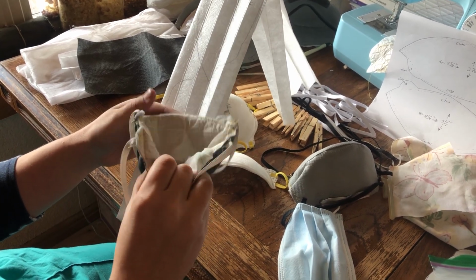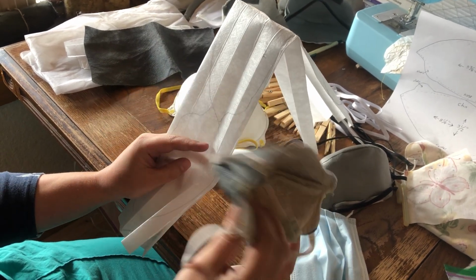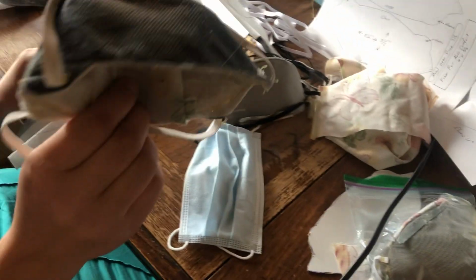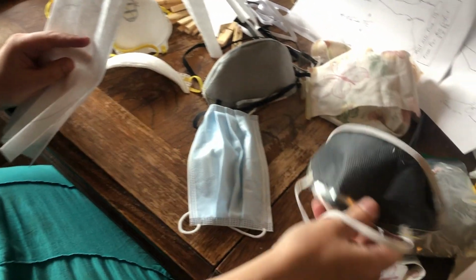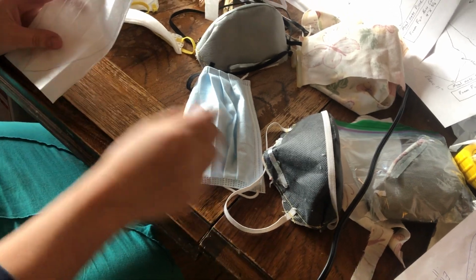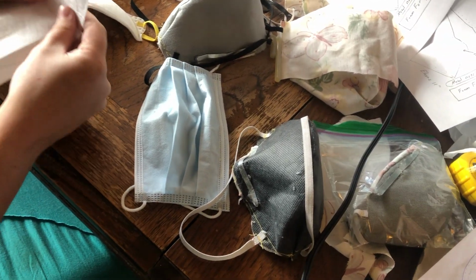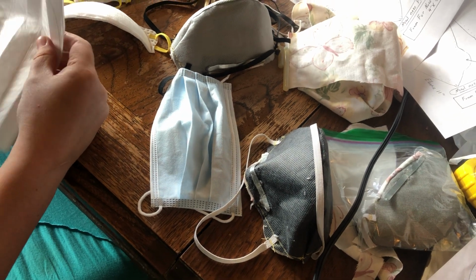So this first one, I put this layer on the inside of my mask, and it was itchy. So that is my first mask, which has shrunk in the dryer. It no longer fits me. I'm going to give it to one of my children. They're really excited about it. It's also got a goopy job because I don't have a glue gun right now. We're just making do with what we got, and I'm using my kitchen stove.